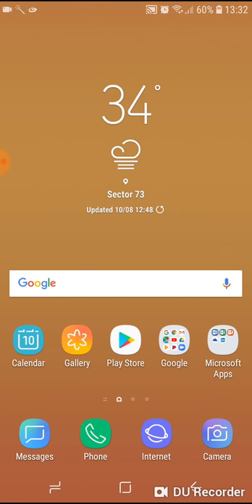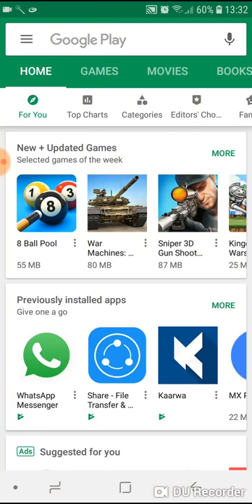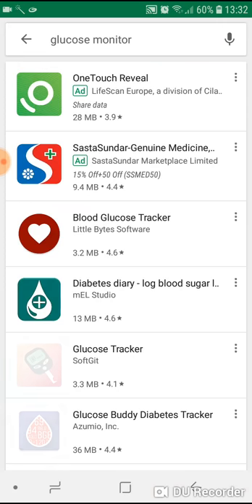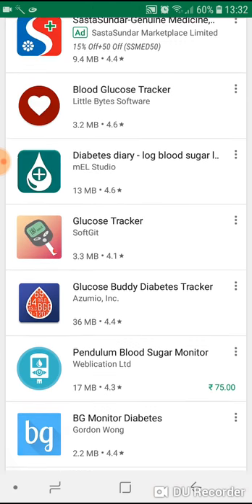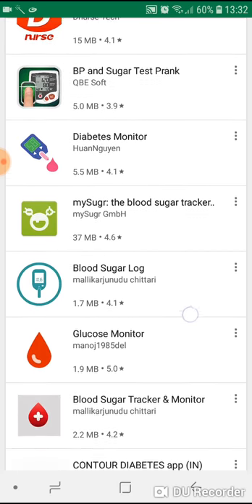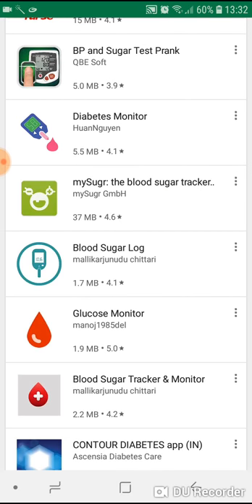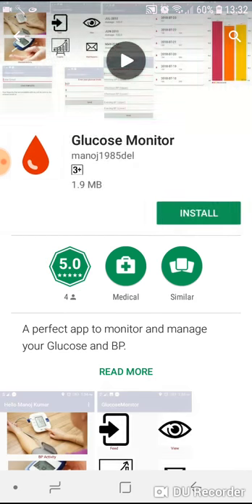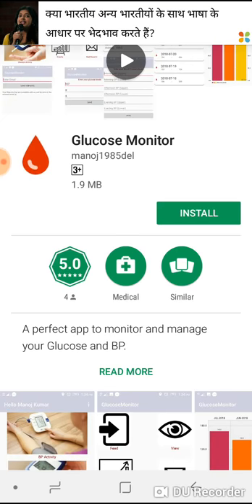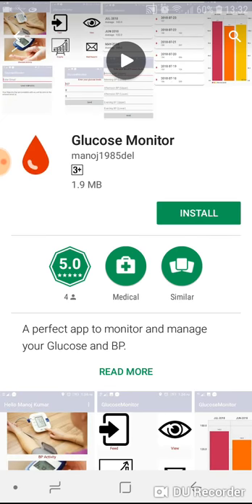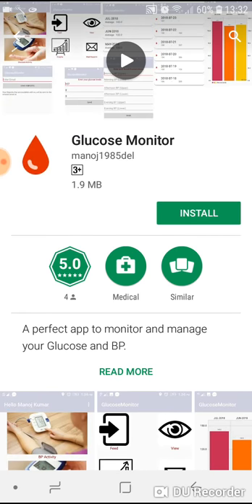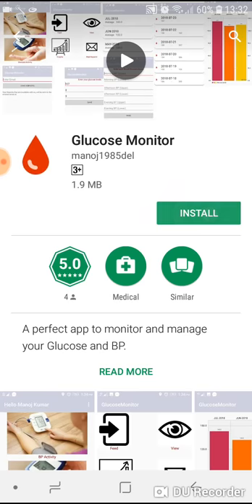From the Play Store, you have to download it. Just type 'glucose monitor' - the blood icon with the publisher name Manoj1985del. You can download it for free. It's a very simple and compact application of just 1.9 MB, so I'll install it.